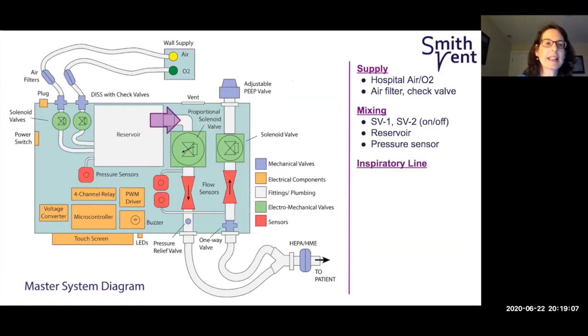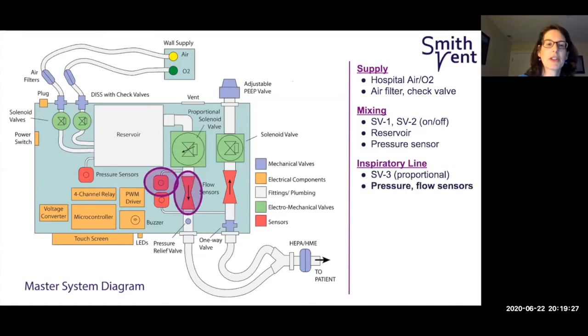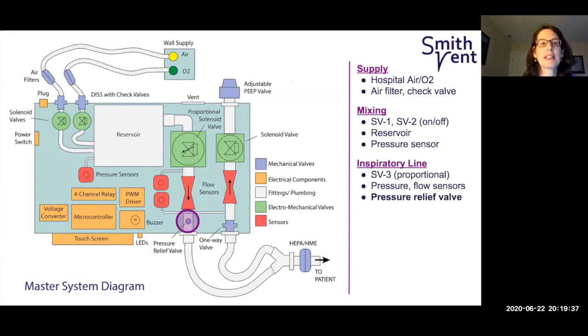So then the airflow exits that far end of the reservoir. It goes into what we call the inspiratory line. The first component on the inspiratory line is the proportional solenoid valve, or SV3, which allows fine control of the flow passing through, something like a very precise dimmer switch. The inspiratory line also has a pressure sensor and a flow sensor, and we use that data to control the proportional solenoid valve, as Neilani will discuss later. And the last component on the inspiratory line is a pressure relief valve, which is an additional safety measure to limit the airflow pressure going to the patient.